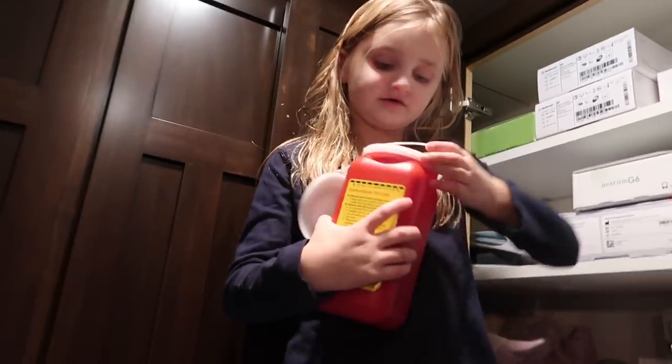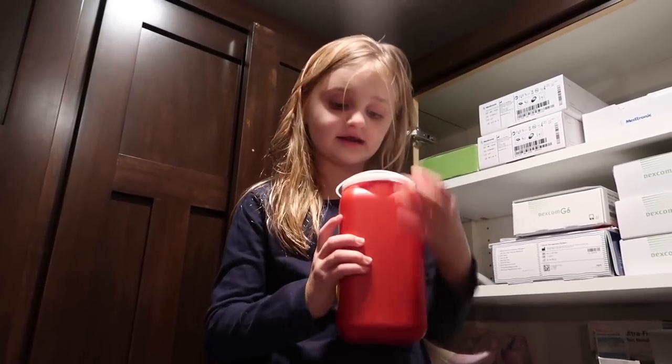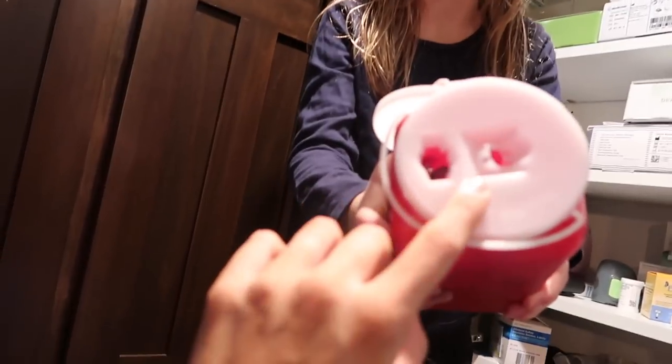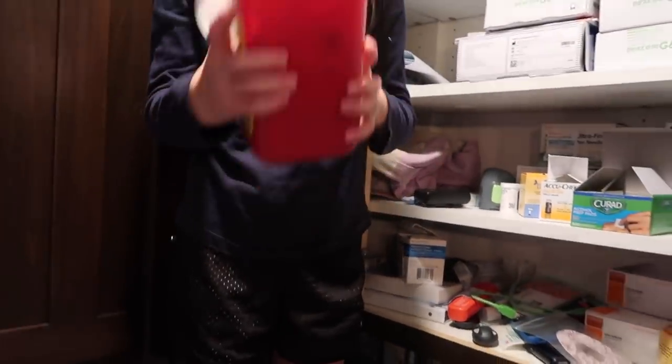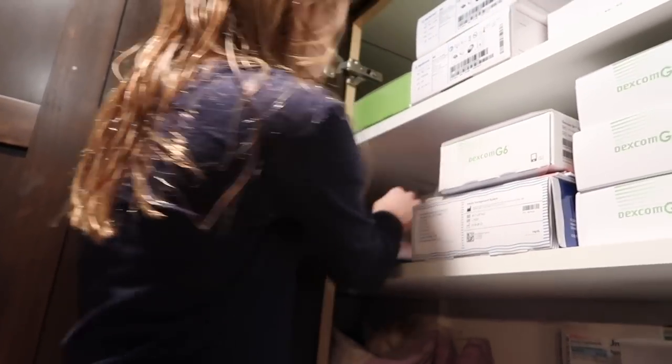That's her needle jar that she used to put all her needles in when she had shots, when she first got it. This is her sharps container — there's a lot of sharps in there. You don't want to fill them.